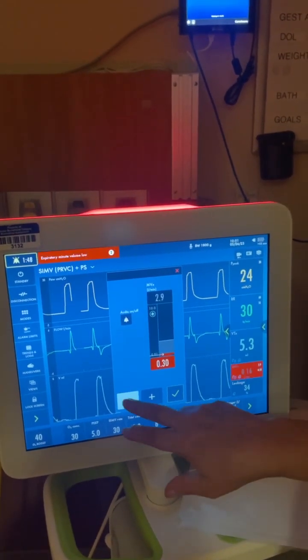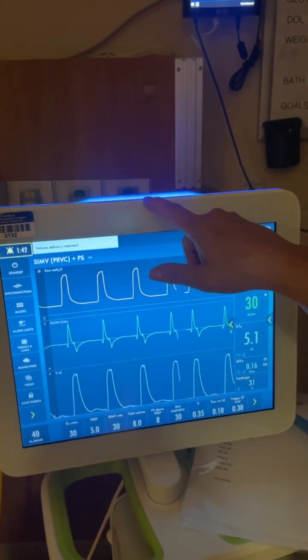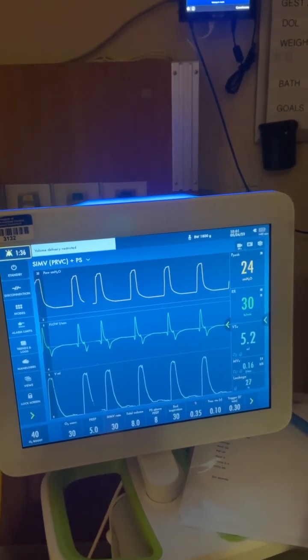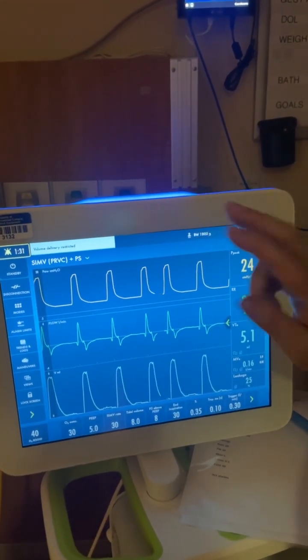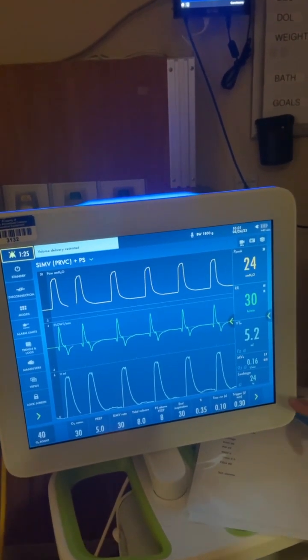So even though it's silenced, it's telling you the problem's not solved because it's red. Does that make sense? And now if I come over and say, oh my God, I'm so sorry, I forgot to set that for you, see how it went blue? And you know the problem's actually fixed. Okay, and there is a yellow one that will alarm and can be silenced as well. And I think the yellow one, you might be able to press it twice and get a longer silence if it's something that you don't need to call the RT about right away.